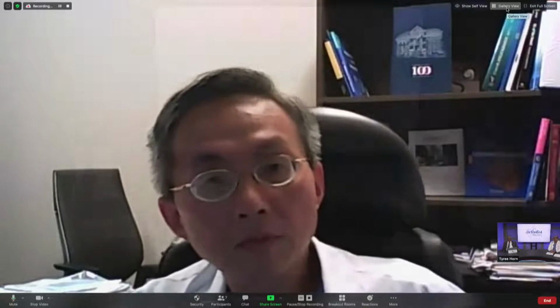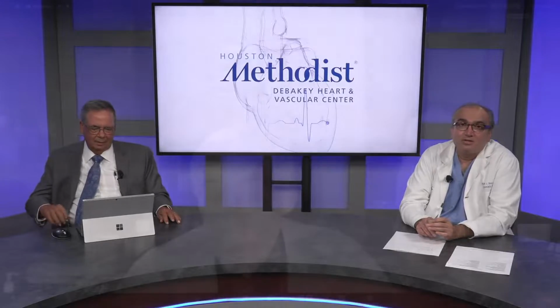Yeah. Okay. All right. John, do you have any comments on this case? Well, in terms of the first case, this is a 39-year-old with extensive atherosclerotic plaque. And I think in this situation, it really is best demonstrated by CTA. I use CTA a lot in patients who are relatively young and have potentially atypical chest pain symptoms, where you're not sure. The importance here is really excluding plaque, identifying plaque, and identifying obstructive plaque if it's there. And identifying non-obstructive plaque is incredibly important because then you can impact it and use lipid-lowering therapy.